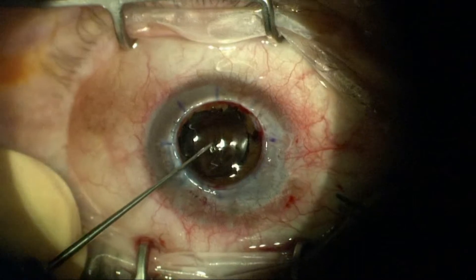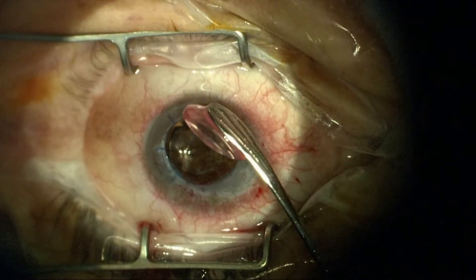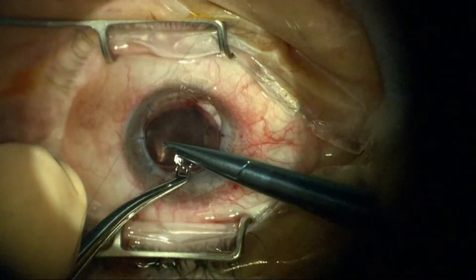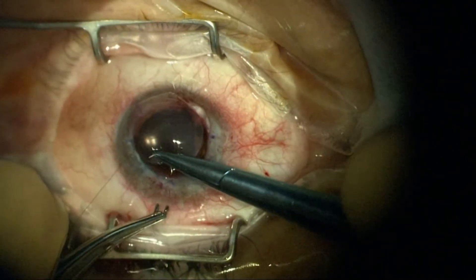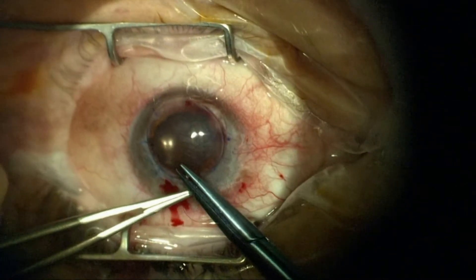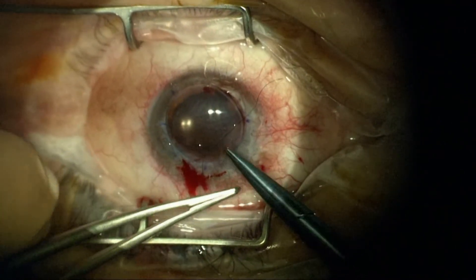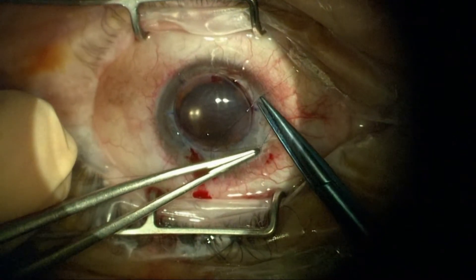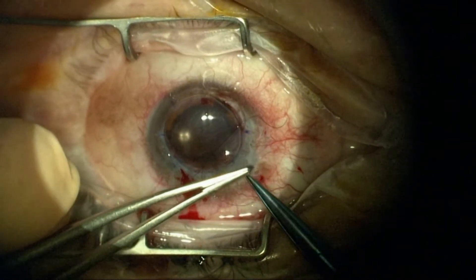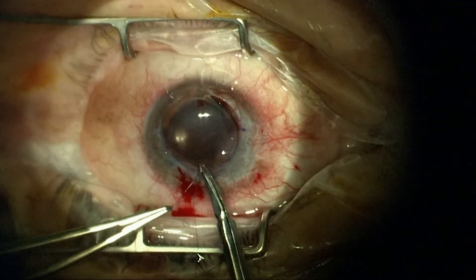Using the donor cornea here, matched size-wise with the recipient bed with just a quarter millimeter difference, and using a 10-0 nylon suture to secure this donor in place. Normally I'd use a running suture, maybe a combined running suture, but with the degree of vascularity and the overall high risk for rejection, I'm going to use interrupted sutures and bury the knots for comfort and to reduce inflammation.